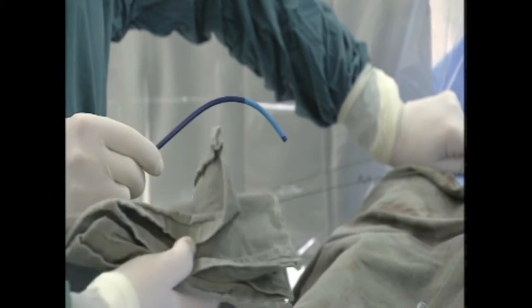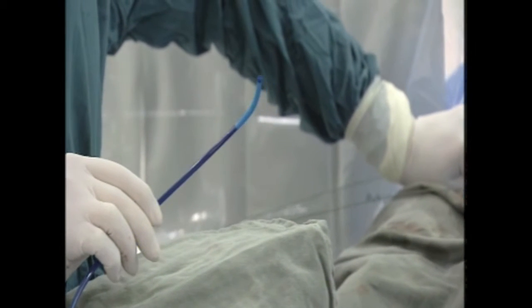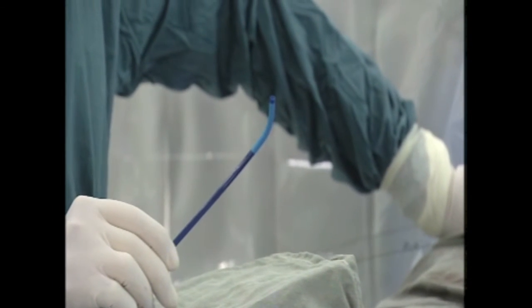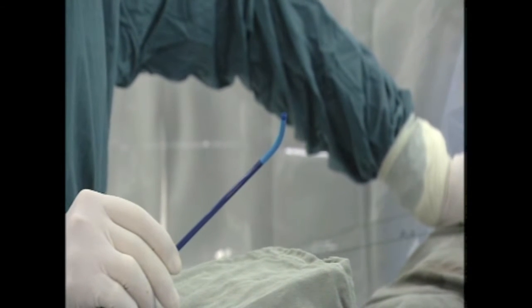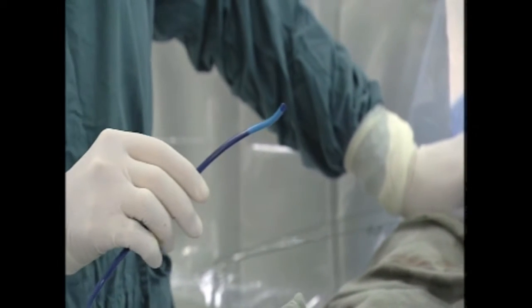So, double curve, because this is one curve in one direction, and when I turn this around, you see that there is actually a second curve, which is not so pronounced as the first one. This is pointing anteriorly, so it's one curve like this, and the other one is this, and it points anteriorly, and that's why it's named double curve. It's usually the curve I start with in most of the cases.